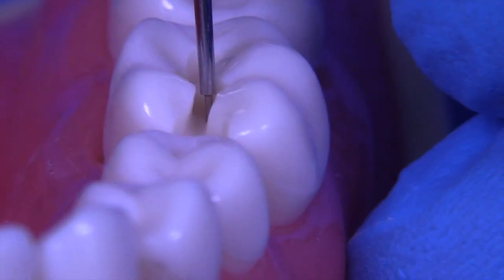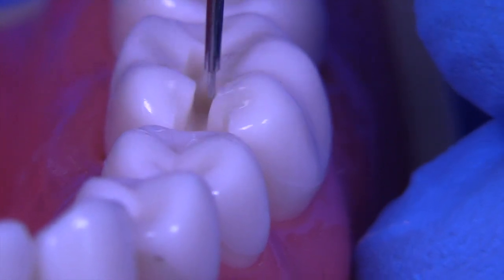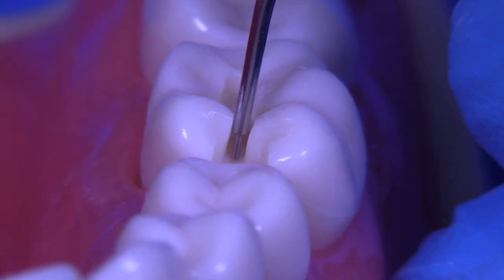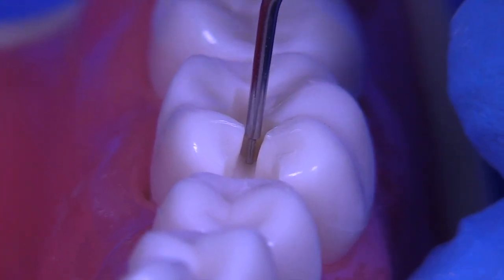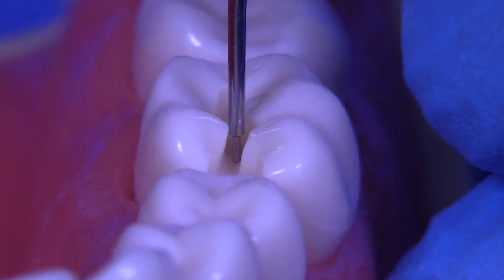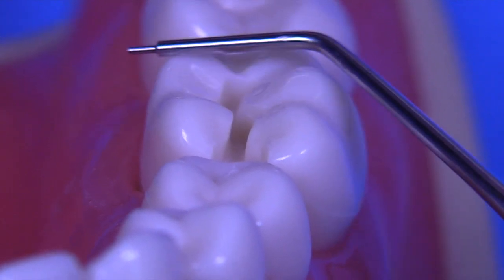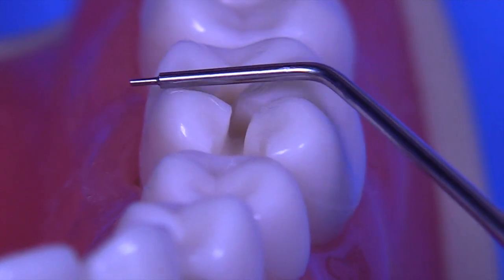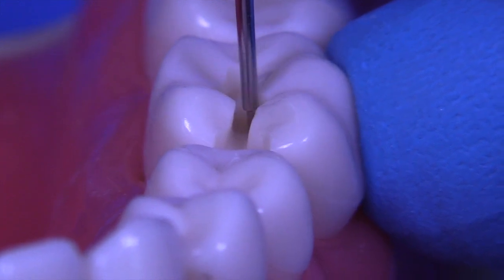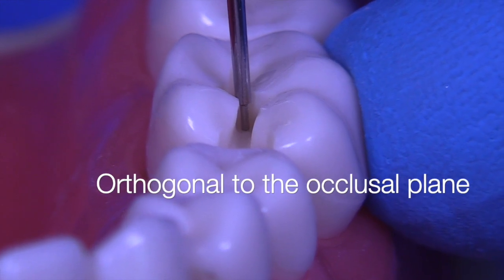So I would have uprighted this area, and then this wall here, rather than being divergent, would have been convergent. But do we lose retention? Not so much, because you do have overall convergence. It's just the way that you got your convergence. You didn't make your convergence perpendicular to the occlusal table. And here's the occlusal table right here like this. You just draw a little line or a plane right across the cusp tips, and you want to make sure that your burr is oriented so that it's exactly perpendicular or orthogonal to that plane.